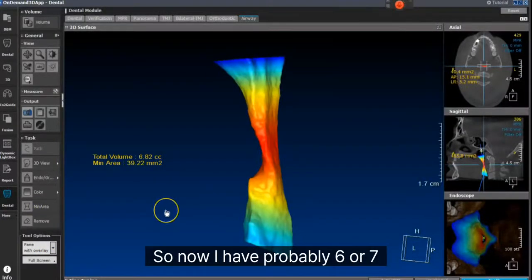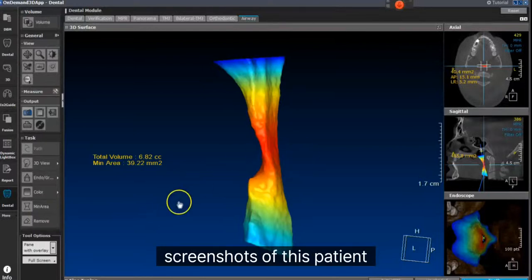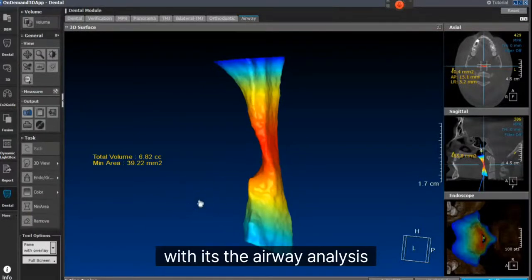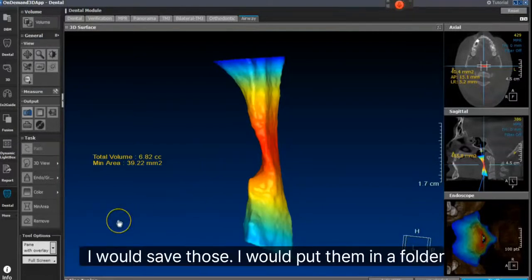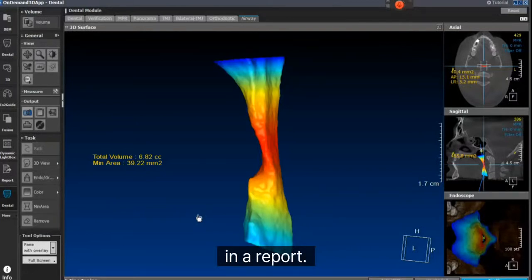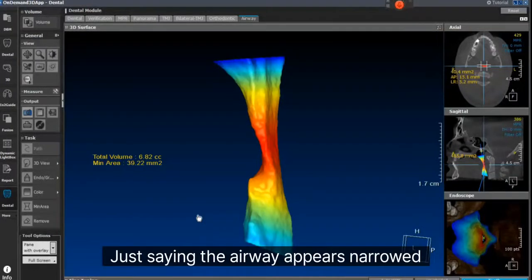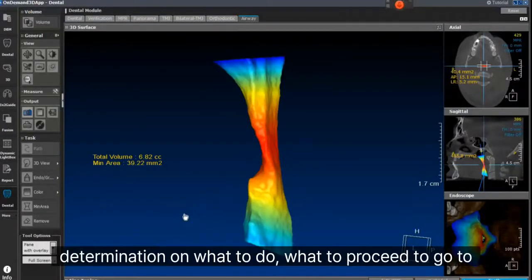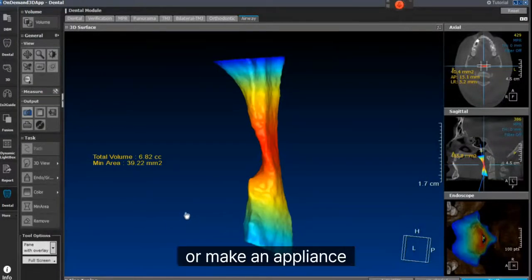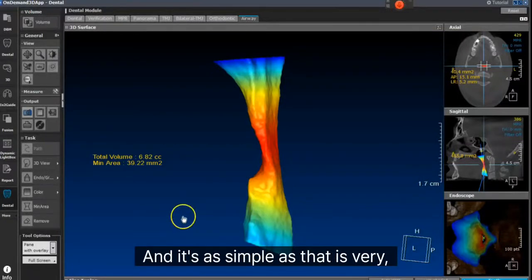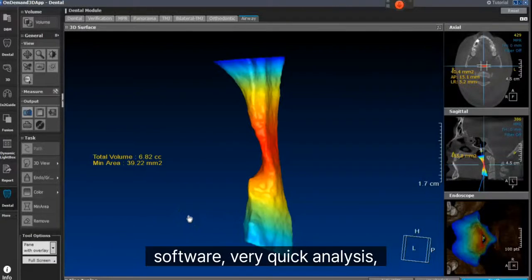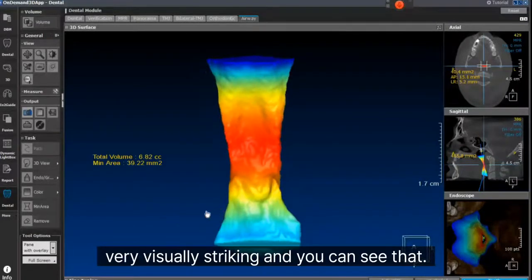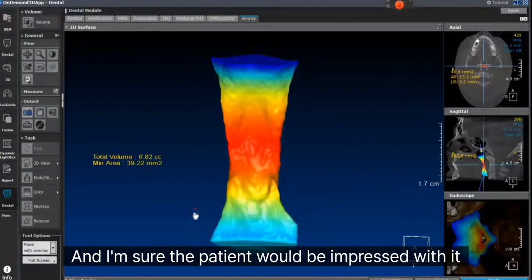Now I have probably six or seven screenshots of this patient with the airway analysis all completed for me. I would save those, put them in a folder, and embed them in a report just saying the airway appears narrowed, and give them those measured images so they can make a determination on what to do — whether to proceed to a sleep lab or make an appliance. It's as simple as that. Very simple software, very quick analysis, very visually striking — I'm sure the patient would be impressed with it as well.